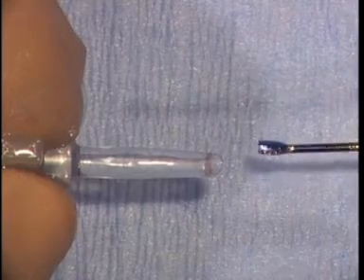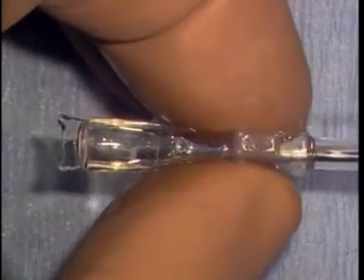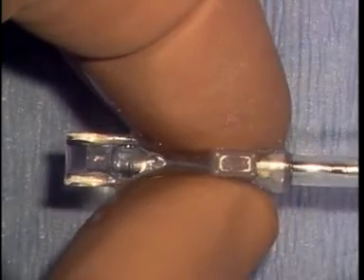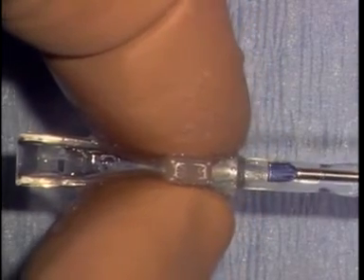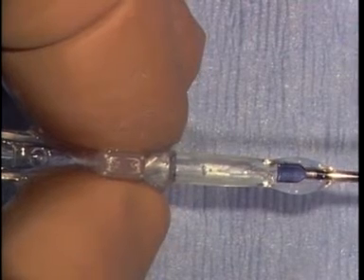Close the jaws of the Visian ICL loading forceps and insert them into the barrel from the front of the cartridge. Advance the forceps through the cartridge until the jaws are about to contact the leading edge of the ICL. Open the jaws of the forceps and grasp the footplate of the ICL so that the lens positioning mark is aligned with the jaws. Slowly pull the lens into the barrel while moving the cartridge in the opposite direction. Observe the lens positioning marks on either side of the Visian ICL optic to confirm alignment as you advance the ICL.